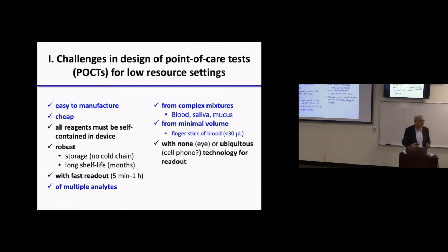It uses classical engineering. We don't want to do it. It's been done, and we're not very good at that kind of stuff. Industry is better at building these kinds of devices. So this was a challenge we had to solve. We had to be able to put all the reagents on the chip, but we wanted a simple solution. And this technology should be robust.